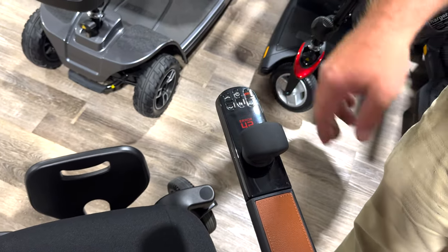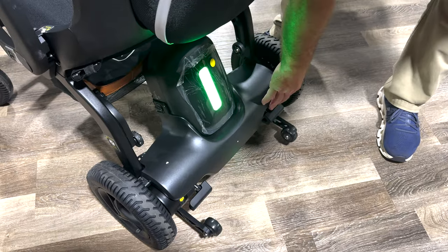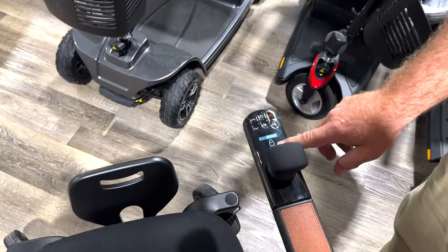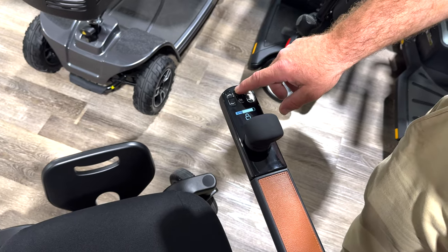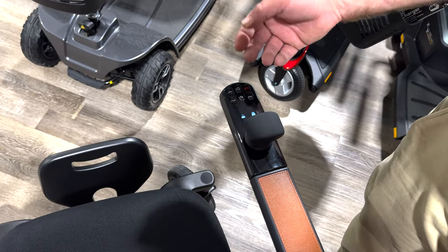So let's go back here to the back. Look at the light that comes on. That's just going to be, flip this up. And back over here, it's locked out. We're at 87%, so it shows your speed and your battery, and it's locked. So I think it's locked because we probably should turn it off and then turn it back on.